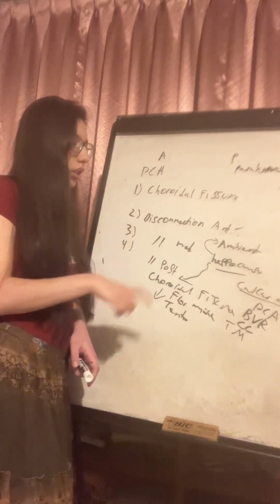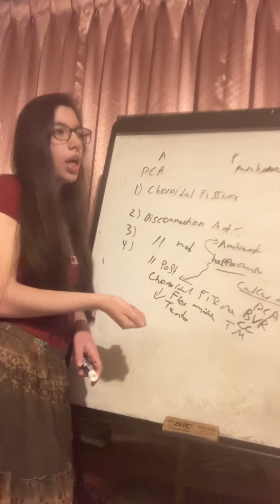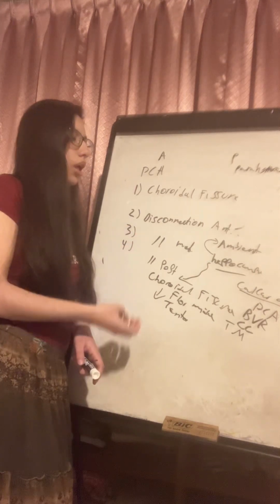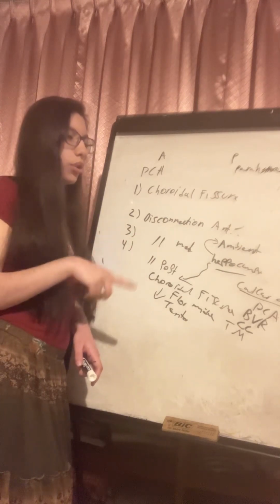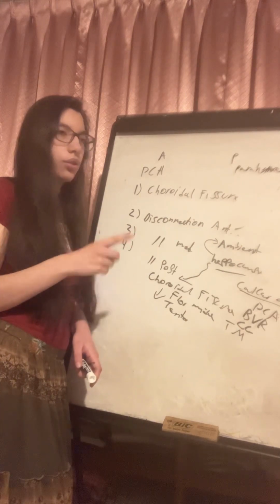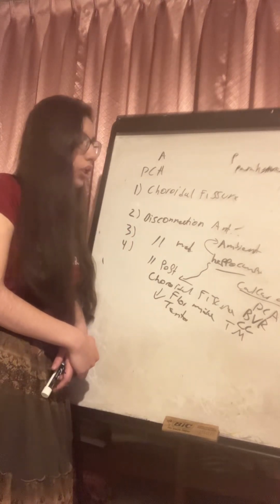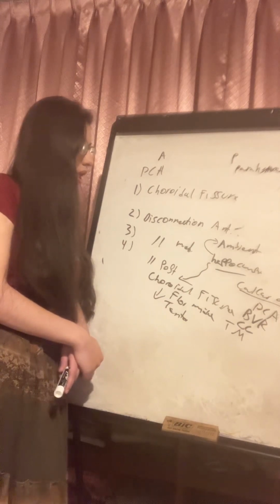And when we see the posterior cerebral artery, the P2A segment, and the oculomotor nerve, we know that the inferior portions of the vertex and of the posterior medial surface of the posterior segment of the uncus have been removed, not the superior portions.